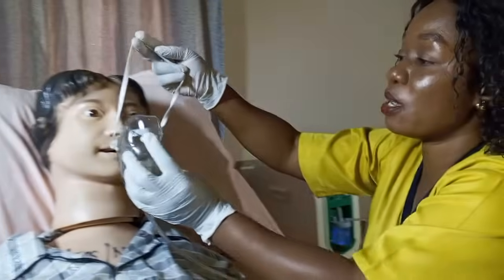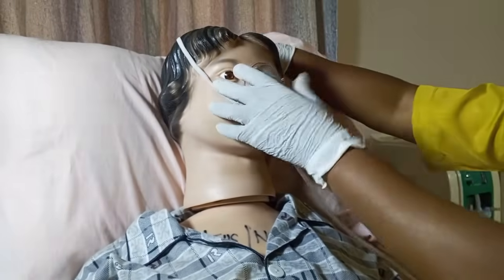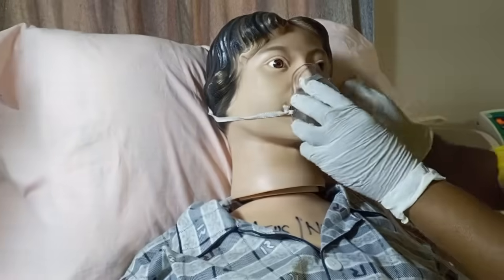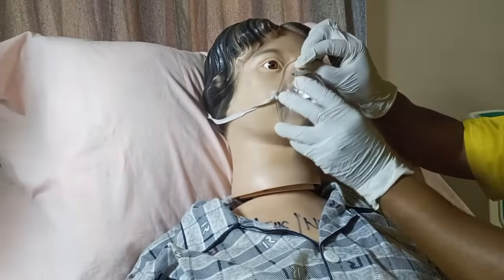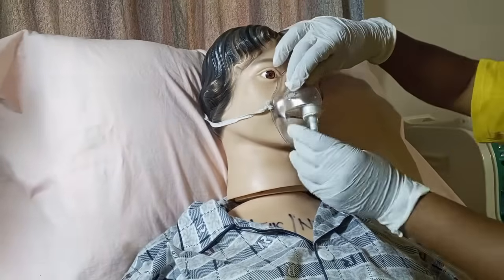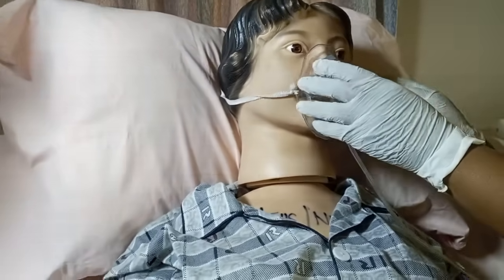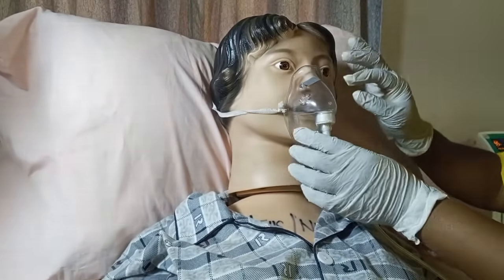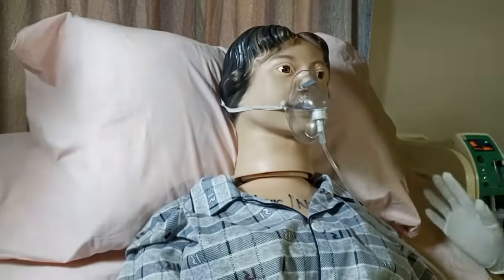Place the face mask on the patient's face. Remember this elastic rope — place it at the back of the patient's head. Make sure it is closed and compress it so that it is tight on the patient's face. Now our oxygen is ready, and we allow the patient to stay with the oxygen.